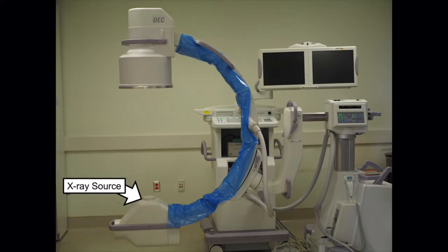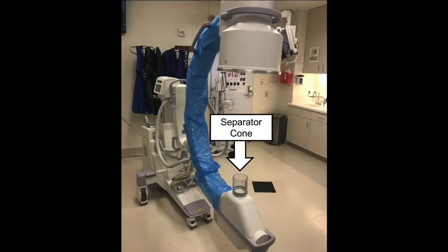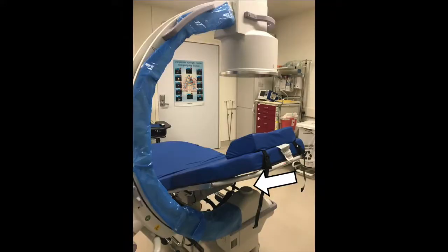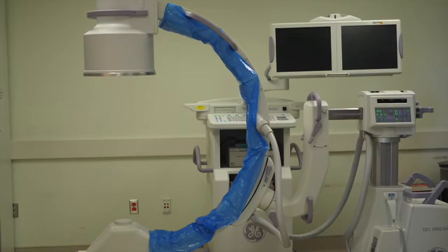This is the X-ray source. The X-ray beam travels from the source through the patient to the image receptor, and converts the X-rays into an image which is projected on the monitor. This is a separator cone, sometimes called a spacer. It is often removed to fit the unit around a bed or operating table. If the separator cone is removed, it is important to keep the patient at least 30 centimeters, or about a foot, away from the X-ray source to avoid skin injury.